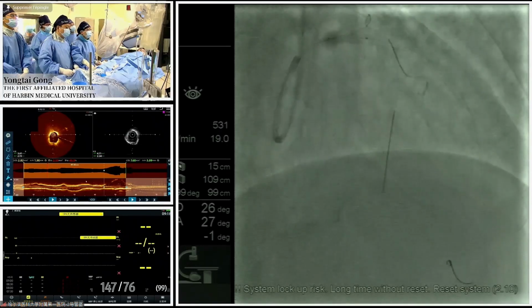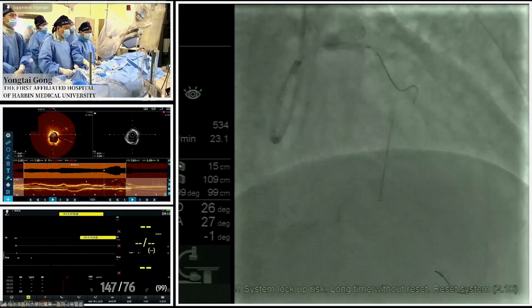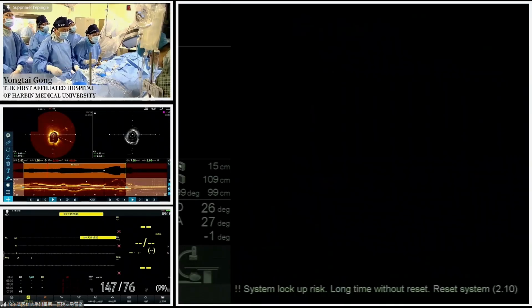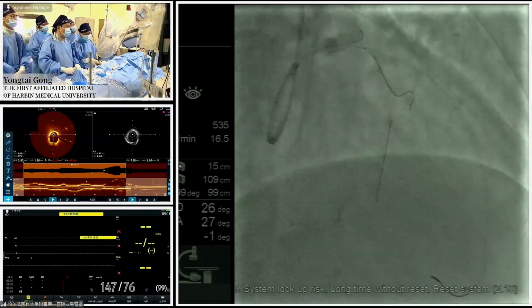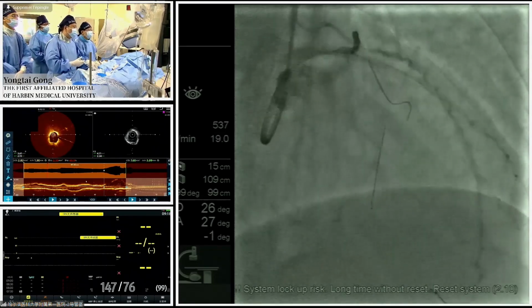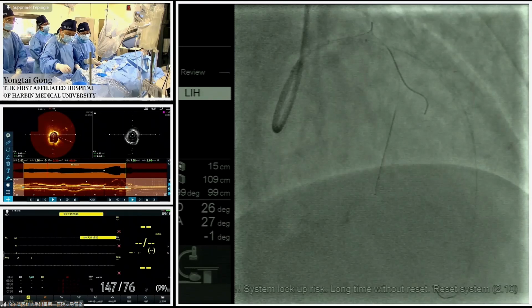This may increase the risk of restenosis of the main branch and side branch. Another technique is the stent kissing balloon technique. In this technique, a stent is located in the ostium of the main branch with a balloon in the side branch inflated to relatively low pressure.